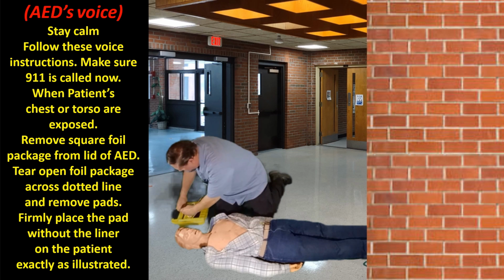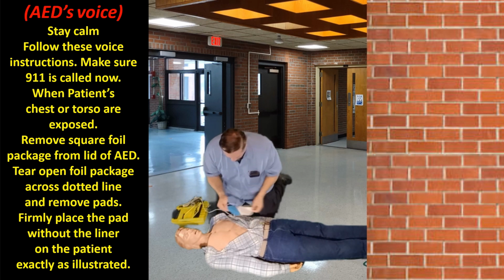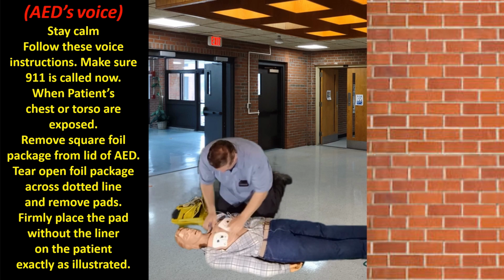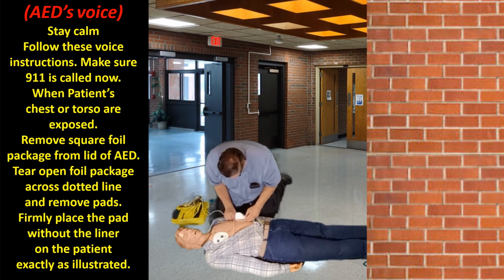Stay calm. Follow these voice instructions. Make sure 911 is called now. When patient's chest and torso are exposed, remove square foil package from lid of AED. Tear open foil package across dotted line and remove pad. Firmly place the pad without the liner on the patient exactly as illustrated.